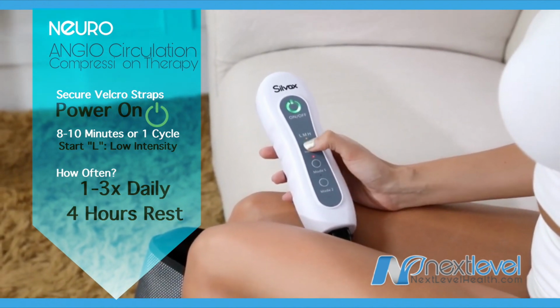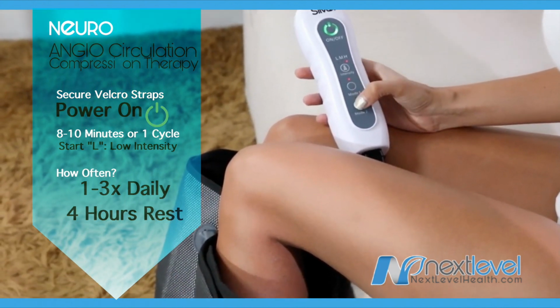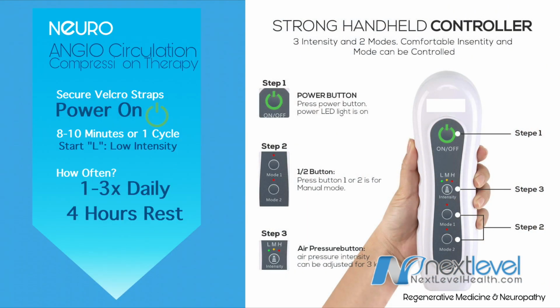Be cautious, though, if for some reason the unit doesn't work correctly and it just keeps going. I would say do not go longer than 10 minutes. Do this 1 to 3 times per day with at least 4 hours rest in between sessions.